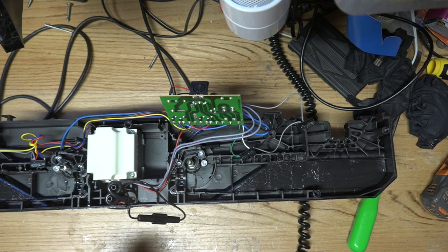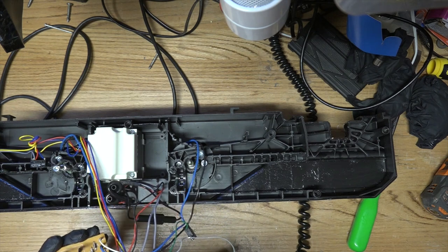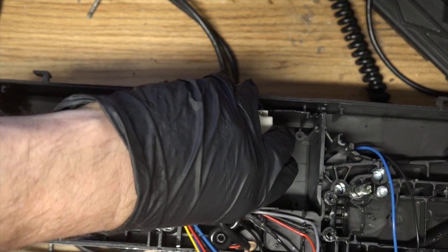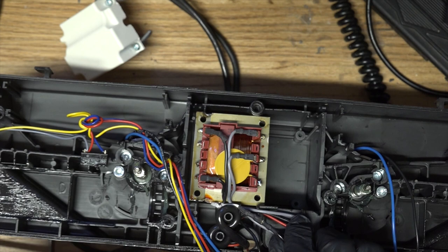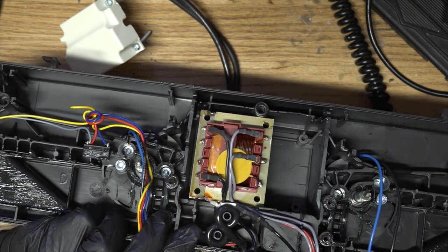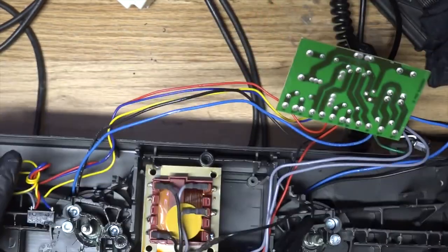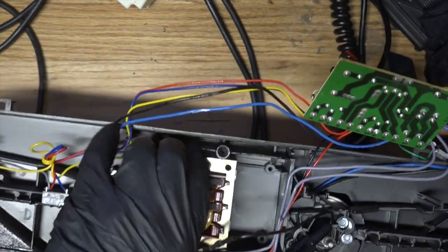So I might put those slides and lead screws and drive sprockets maybe just in a plastic bag to hang on to. Well, I wonder what the voltage is coming out of this guy. I wonder if we could tell here. Okay, here comes, ooh, that's some long screws on there, huh? Yeah, that must hold the whole transformer down. Let's make sure we're unplugged first. Yeah, we are. And here's the power cord coming through. There we go. Oh, it's out. Perfect. So I'm just going to grab that whole transformer, and it should pull out of there now.